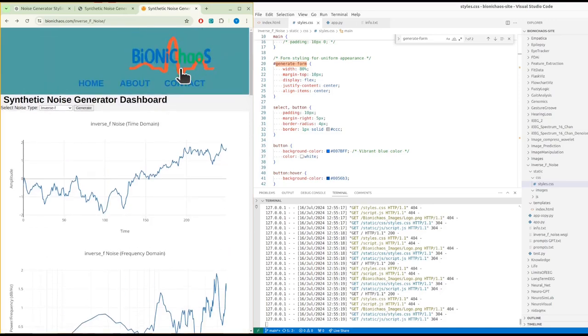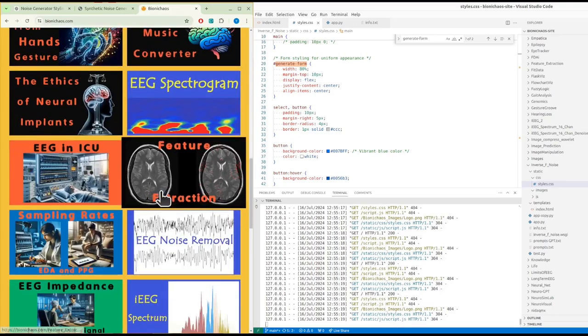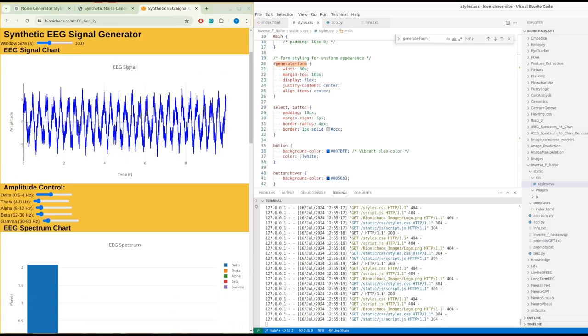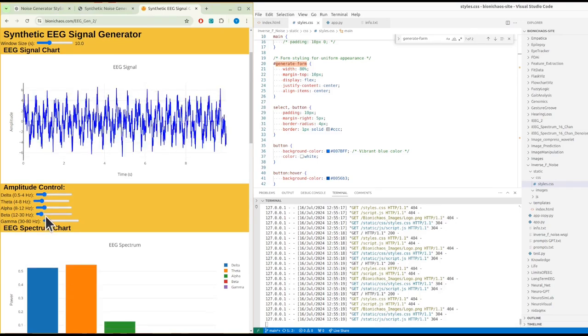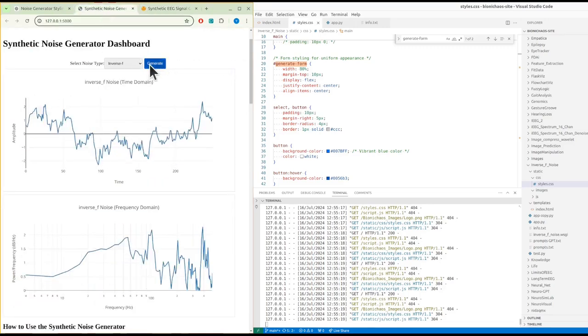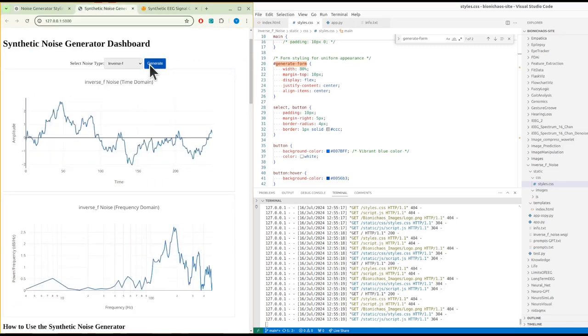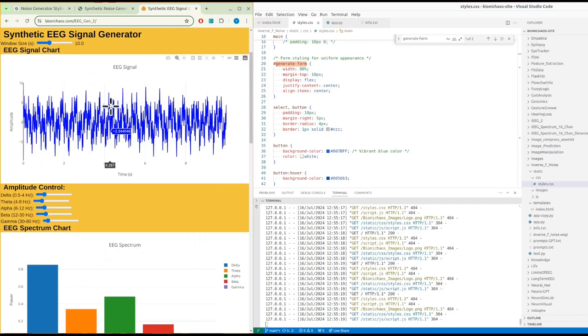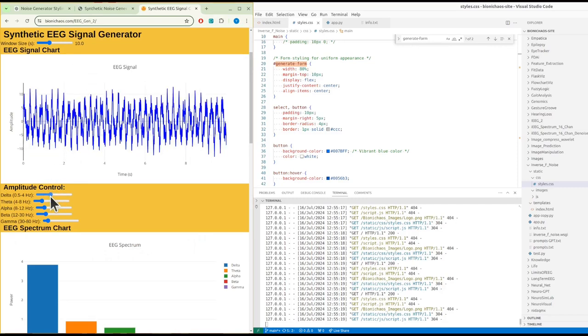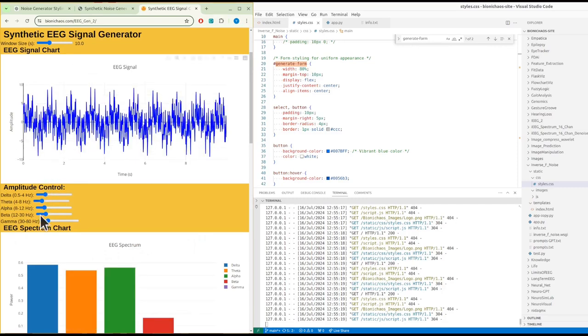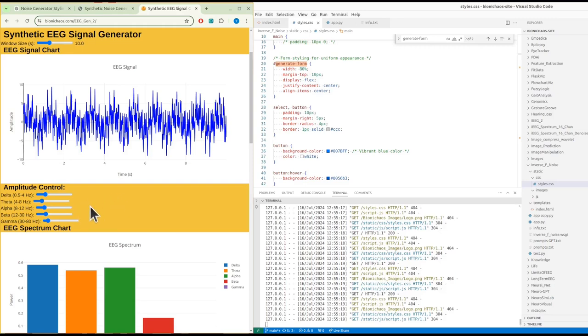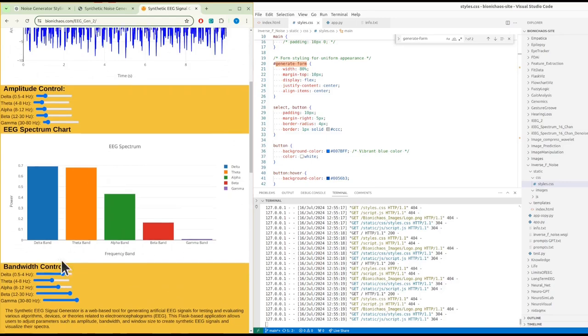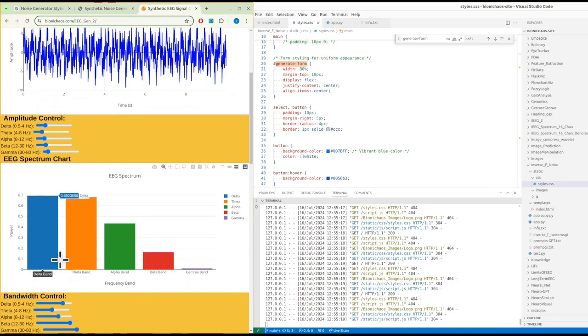We'll be updating our EEG generation tools. We'll be adding some sort of play button that will keep continuously generating the waveform. There will be a play button to change the speed and it will be updating those charts. They have noise in them. This one can be doing some sort of activation. Eventually would be gearing towards mimicking epileptic seizures as well by essentially adjusting those parameters.